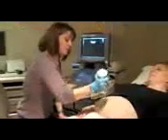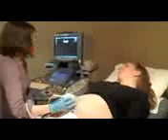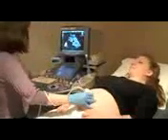Ultrasound is an imaging modality that's commonly used during pregnancy. It uses high-frequency sound waves that bounce through the tissues and then back again to the transducer to create the image on the screen. The doctor or technician performing this procedure will place ultrasound gel on your abdomen. This is a type of conductive medium that helps the transducer emit and receive the sound waves through the skin. This transducer will be moved across your abdomen as the fetal structures are examined.